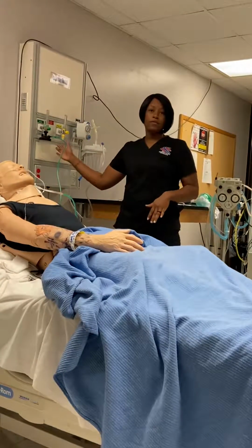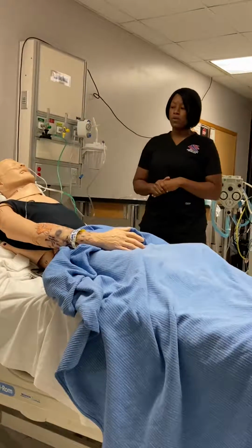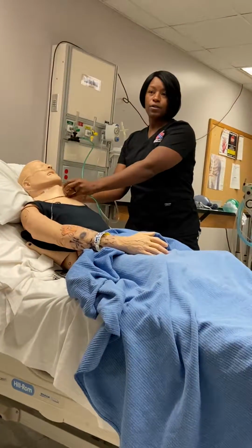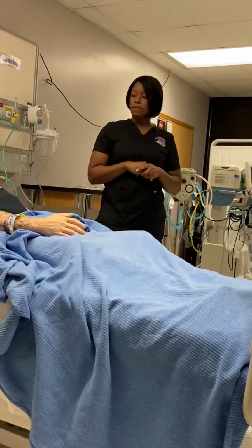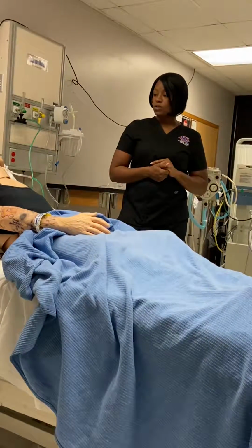Make sure I monitor the fluids, make sure it's all right. I'm gonna record humidification use, and I'm gonna report any changes or additions of the humidification therapy to the doctor. I'm gonna report any abnormal findings to the doctor, and I'm gonna gather all my equipment. I'm going to wash my hands, and then I am going to chart.